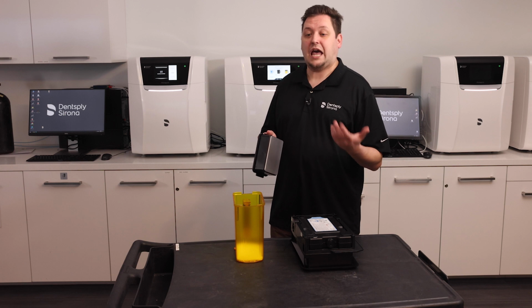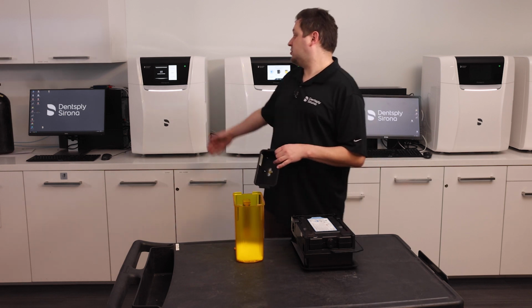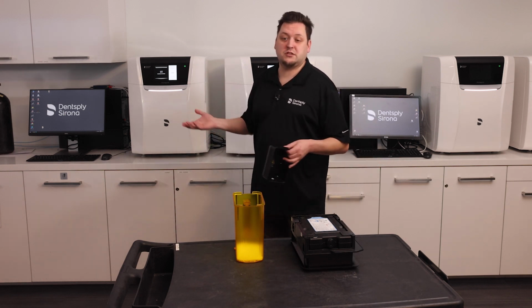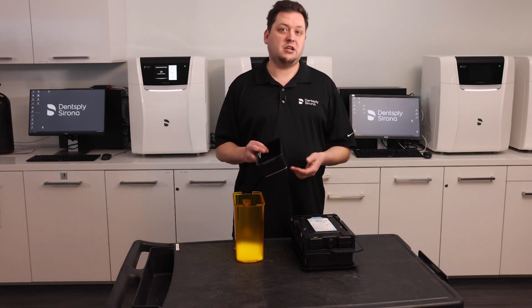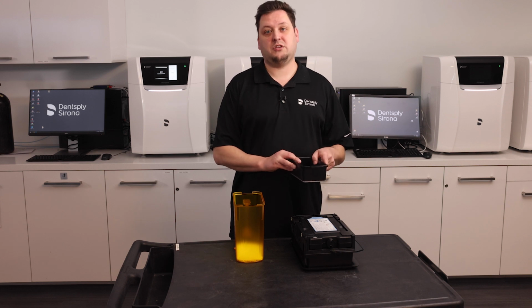Once there's enough resin and it's been heated, it will hold it at that temperature for the requested time, which is, in this case, 1 hour. So keep in mind, in order to do preheat, the build plate will be immersed in the resin.